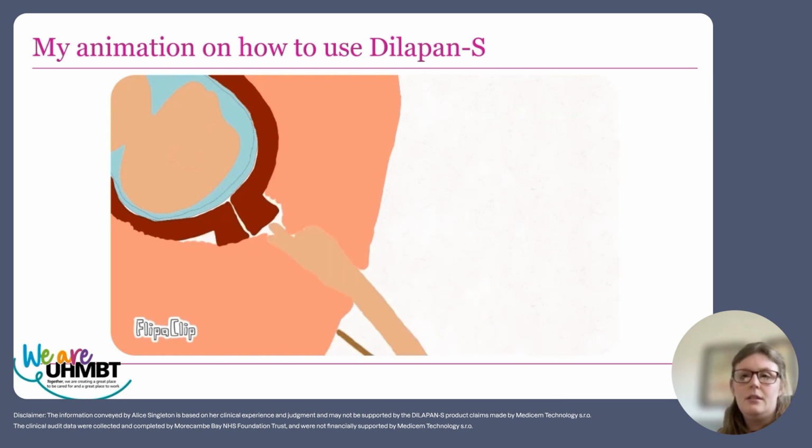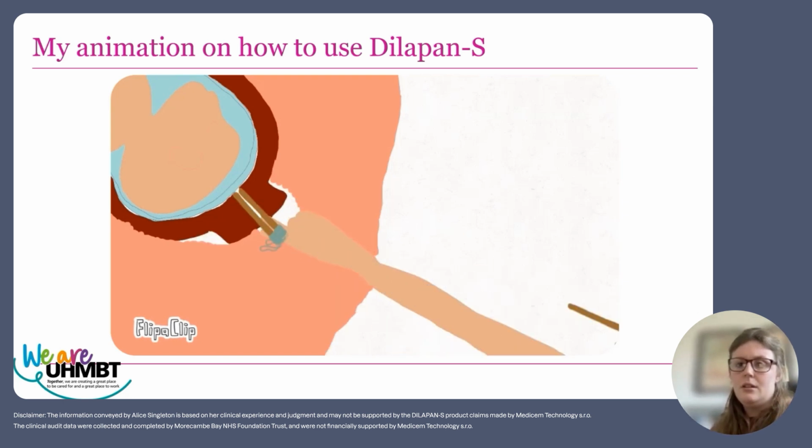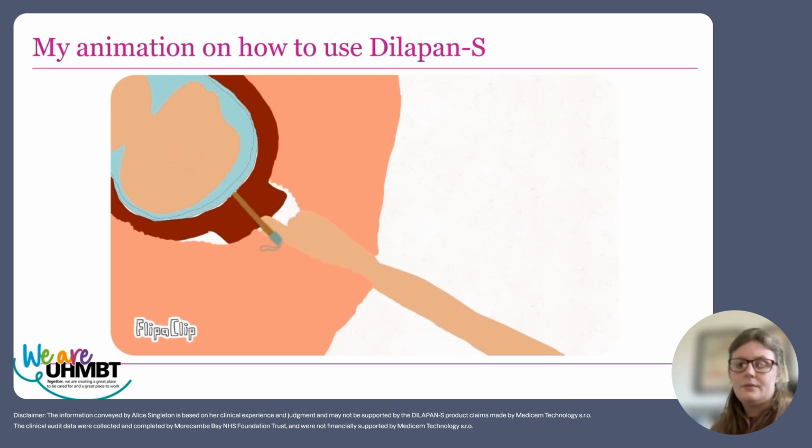Let's now consider digital administration of the Dilapan using the sponge holding forceps and inserting the Dilapan one by one as you previously have done with the speculum. And finally, let's look at how to administer Dilapan completely digitally.